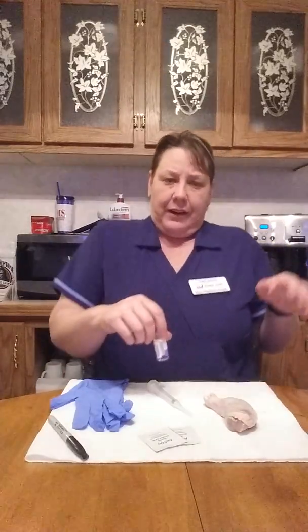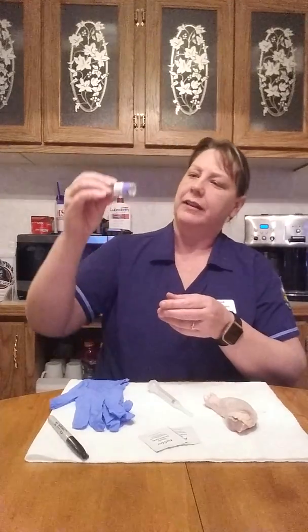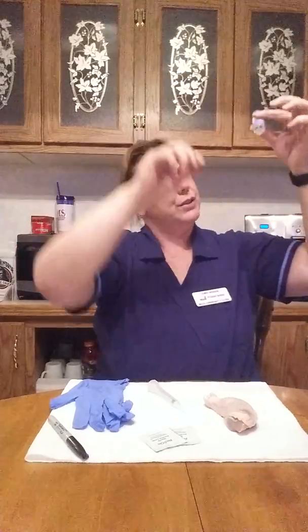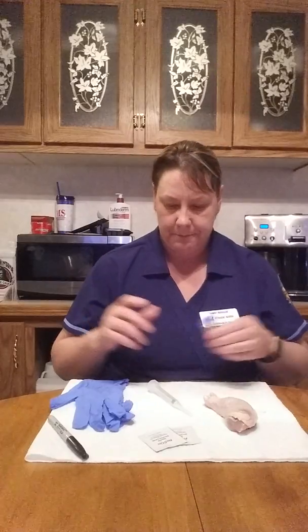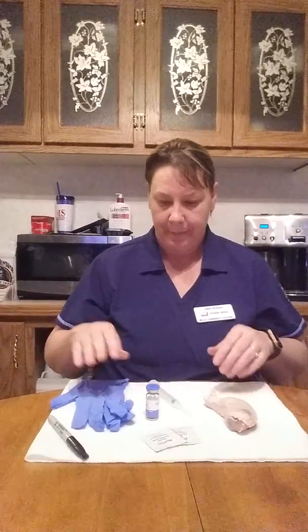So after I've verified everything through the medication administration record, I'm going to go ahead and check the vial of medication and make sure there's no cracks and no crystals in the solution, and there doesn't seem to be, so that's good. I'm also going to check the expiration date on the vial, and it's good till 11 of 2020. So once I've done that, then I'll be ready to get everything going.